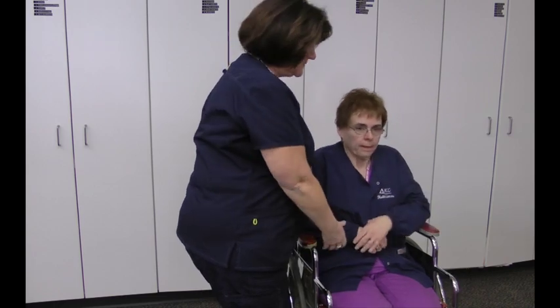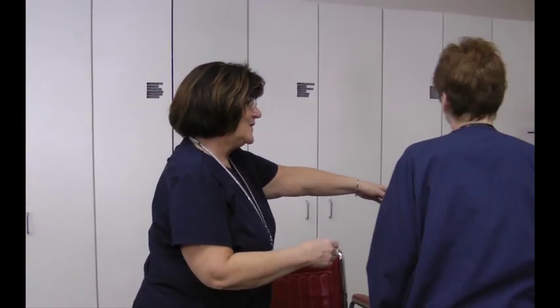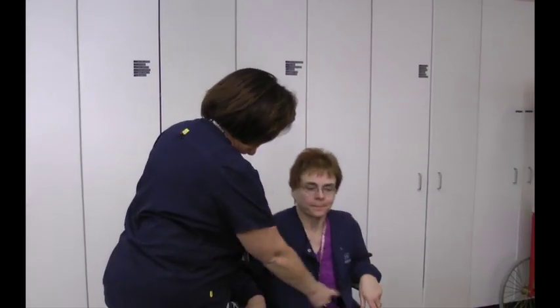Just have them stand up. Melissa, can you stand up? Can you stretch a little bit? Okay. And can you turn around? And go ahead and sit back down again. That's exactly what we mean. And then we would put the restraint back on and reposition them.